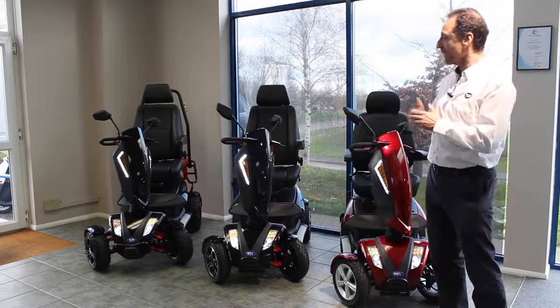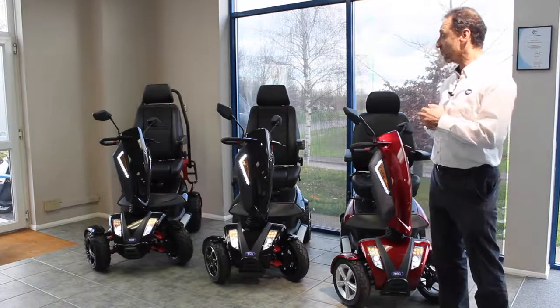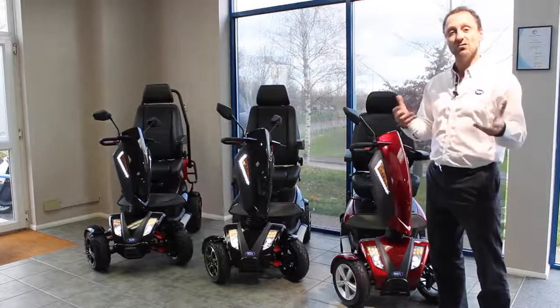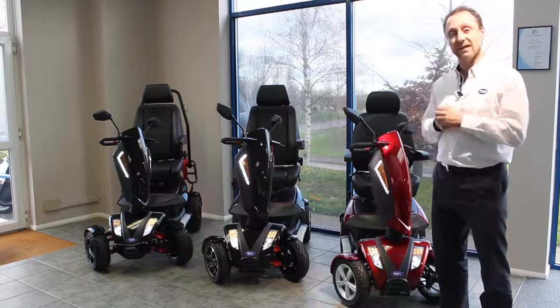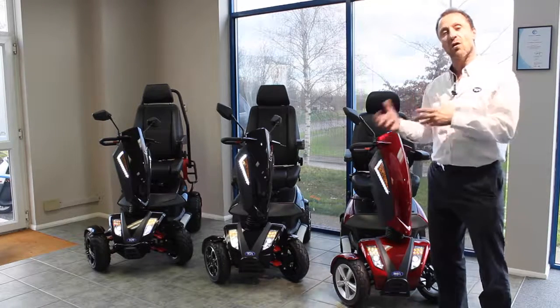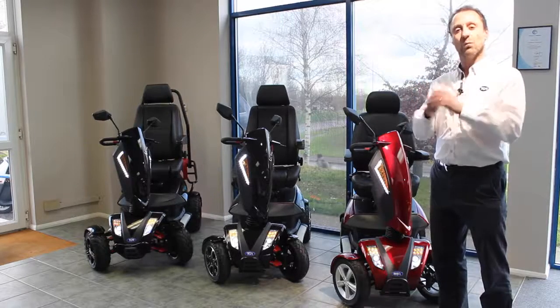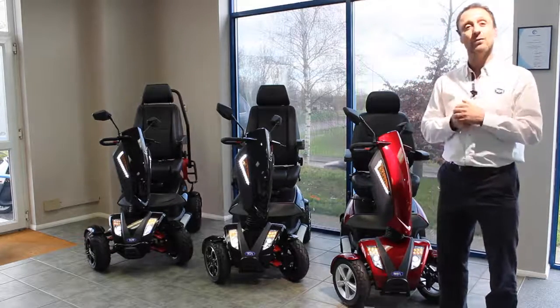Slightly higher spec as well, and at the top of the range is the Vita X, which as well as having a bigger battery — which means you can go a bit further — has a similarly very comfortable seat, and it also has some tyres that are going to be really good for off road. So you can really go places that you want to go and be very comfortable in doing so.